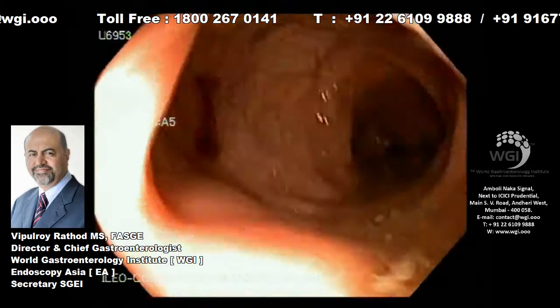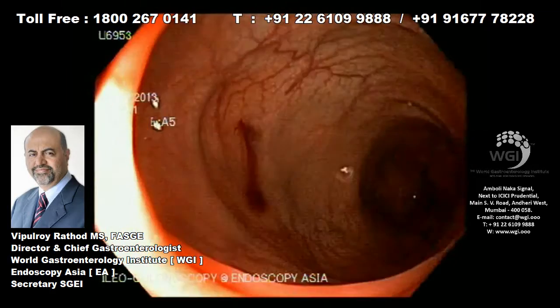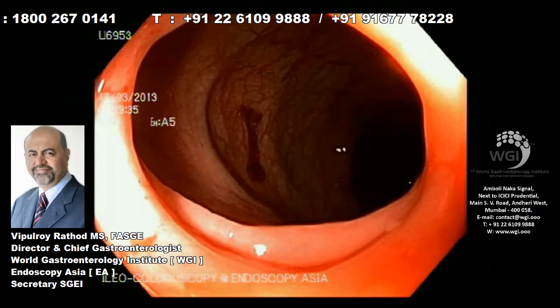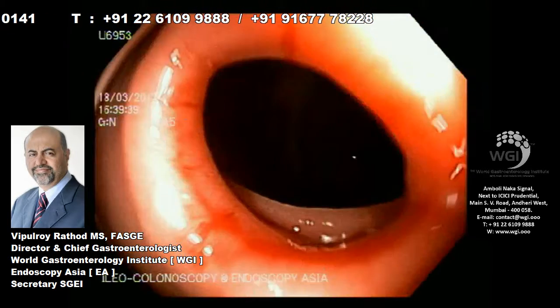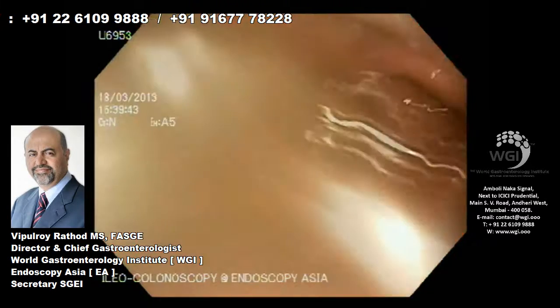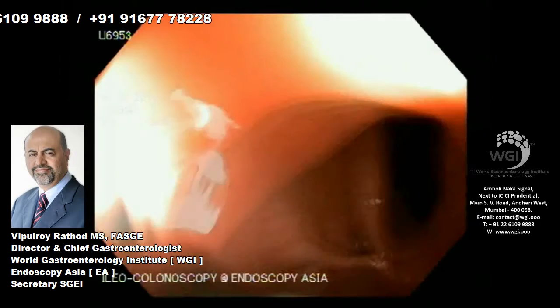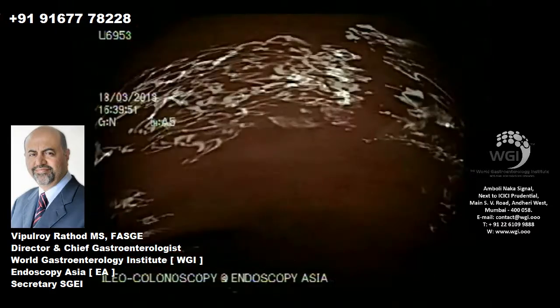As we come down, we return to the strictured segment noticed at the beginning. There is some transported blood from the recent dilatation, but certainly there is no evidence of any neoplastic process, or diverticular disease, or any pathology accounting for this benign stricture. We evaluate the bottom of the colon in detail, and all is normal.